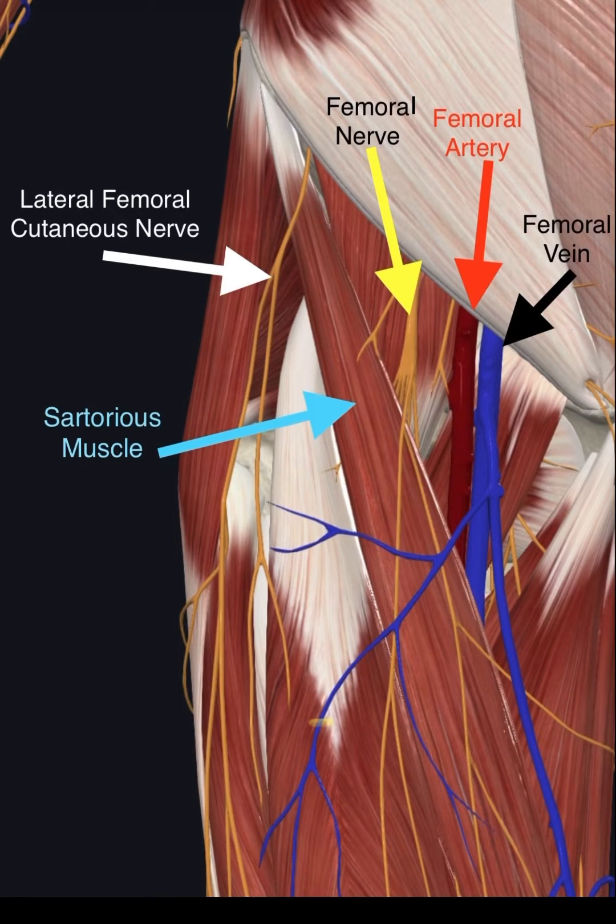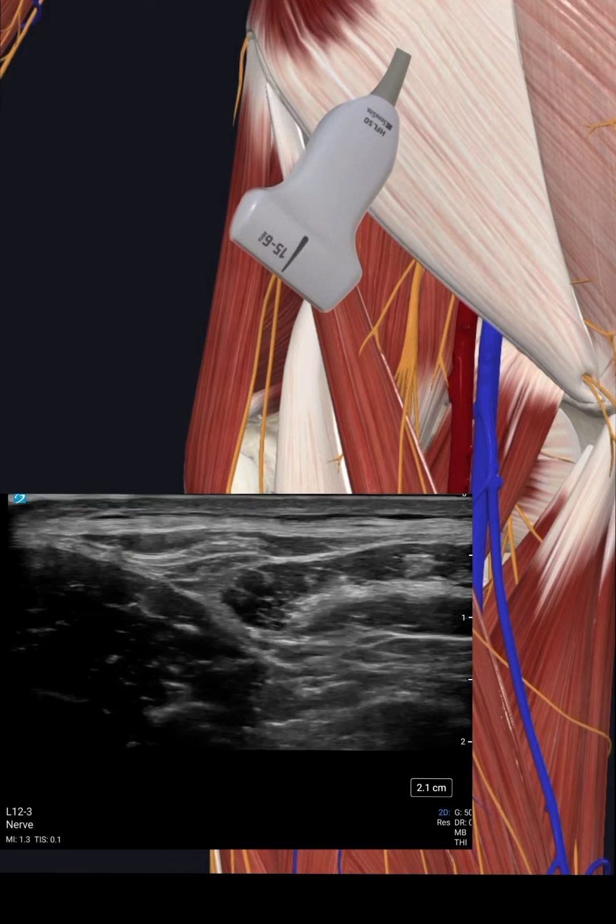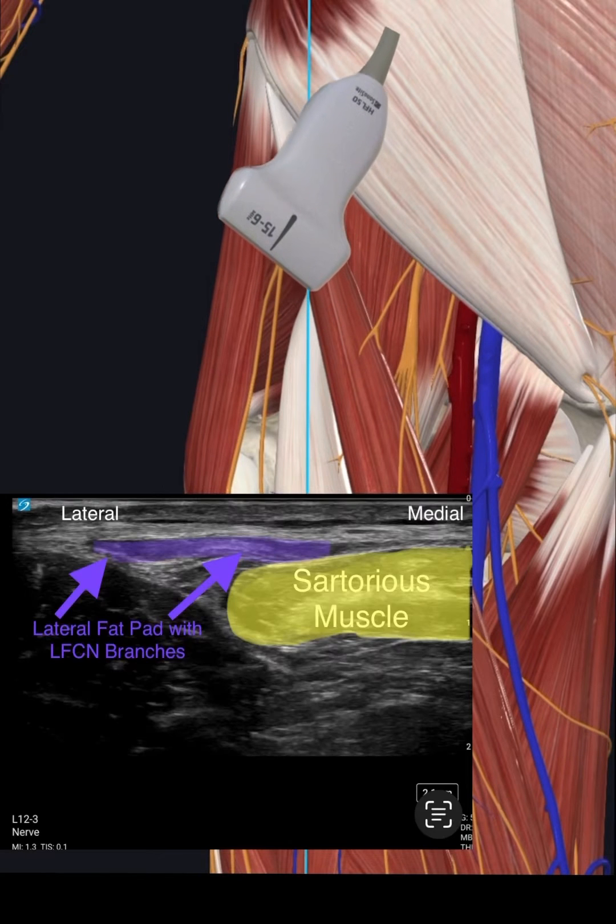It is best to begin the exam with the ultrasound probe placed over the common femoral artery and moved lateral, just distal to the inguinal crease, in order to block at the correct level. Once located, the nerve may be tracked distal and proximal to ensure successful identification.